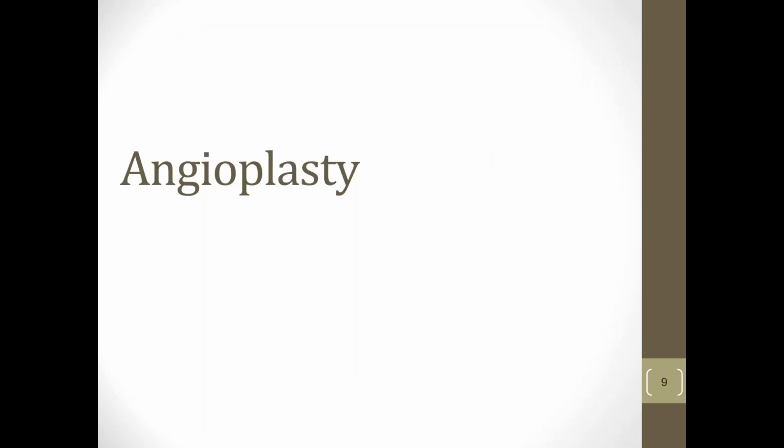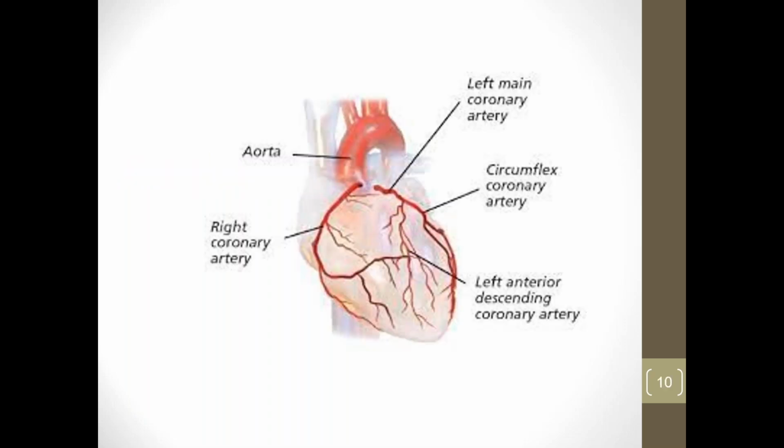Angioplasty. So what they were looking to do is come up with ways to get into the body and do things to help patients recover. And so basically what they're doing in the cath lab, for people that may not have been in the cath lab very often, is they're fixing these coronary arteries. And these are on the outside of the heart. So rarely does the cath lab get inside to the actual chambers. Most of the work in the cath lab is on the outside.